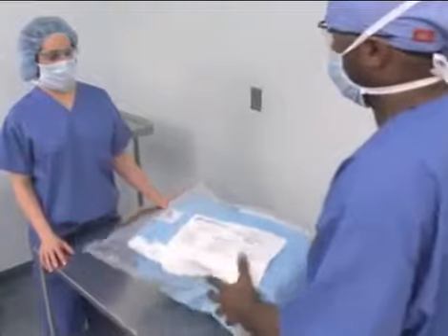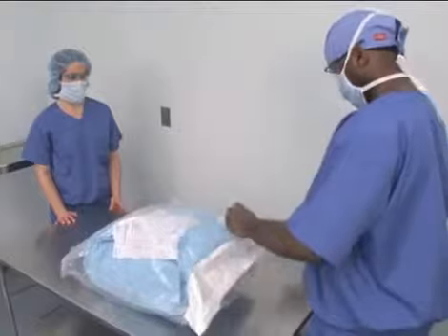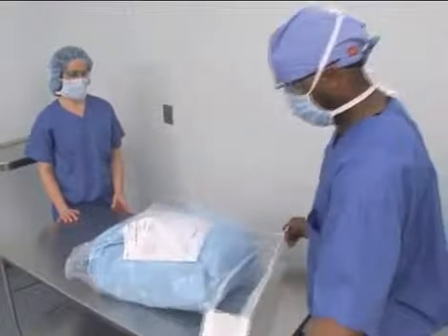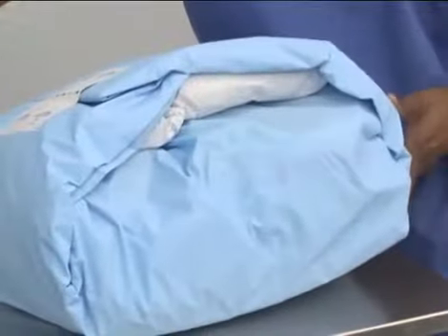Any packages with tears, holes, or watermarks are contaminated and should be removed from the room for reprocessing and replaced with new packs. To open the large pack, which is positioned on the back table, center the pack on the table and orient it so the long ends of the outside drape line up with the long end of the table. If the pack is very large and has been square wrapped, the recommended practice is to move around the package rather than reaching across.